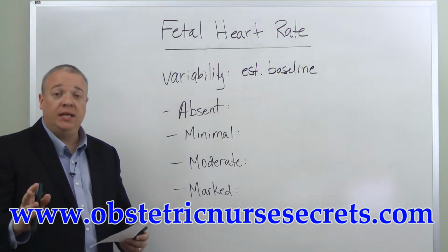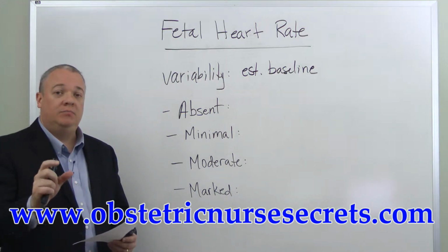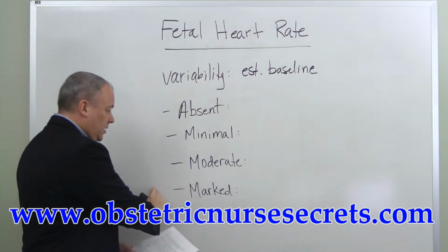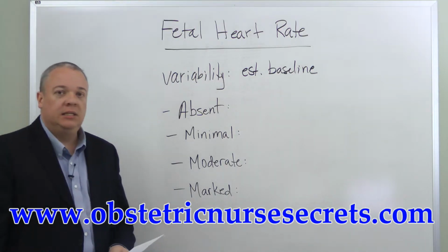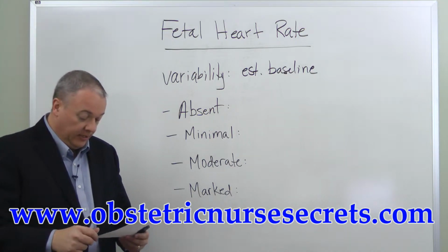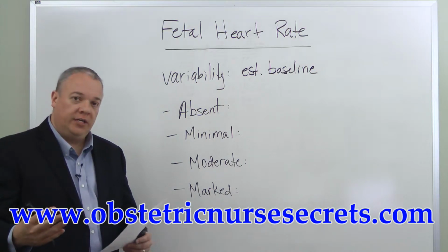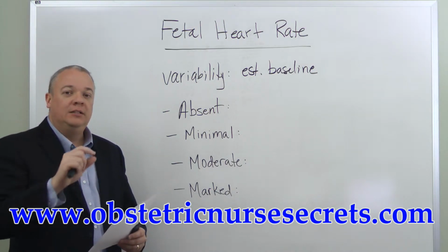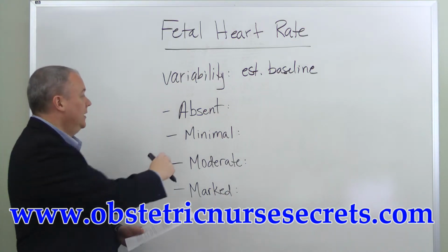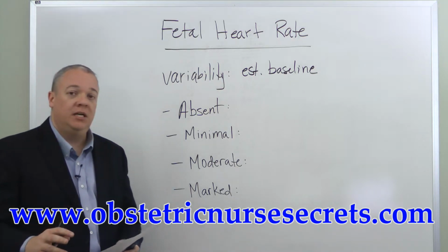heart rate, and finding within that 10 minutes 2 minutes in which there is a consistency in the heartbeat, no marked variability, nor do you pay attention to parts of that 10-minute strip that might include episodic or periodic changes due to various factors. So you're looking for 2 minutes of a heartbeat that is more or less consistent, falling within this range between absent and moderate in terms of changes to the heart rate.